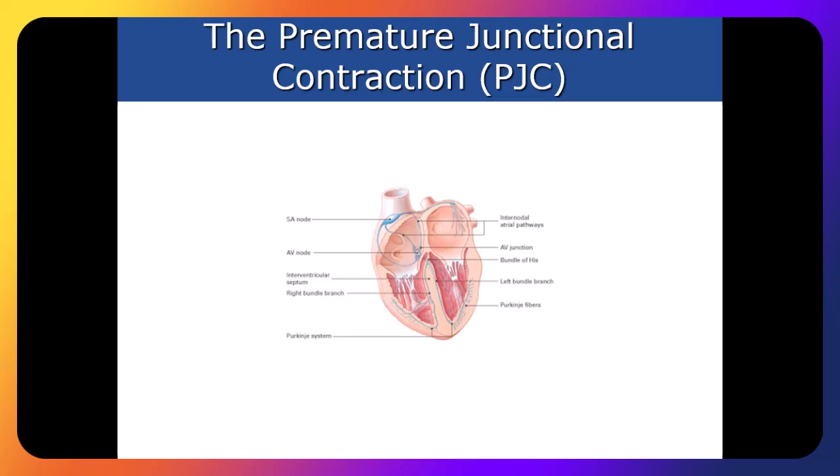You told me about the PACs, and you'll feel lucky that you got like a 0.5 on your score, but you forgot to tell me the underlying rhythm. Bunch of you gave me really good answers as far as the conduction ratio for the two A flutter rhythms that we had. Almost nobody gave me the conduction ratio for the secondary blocks, though.